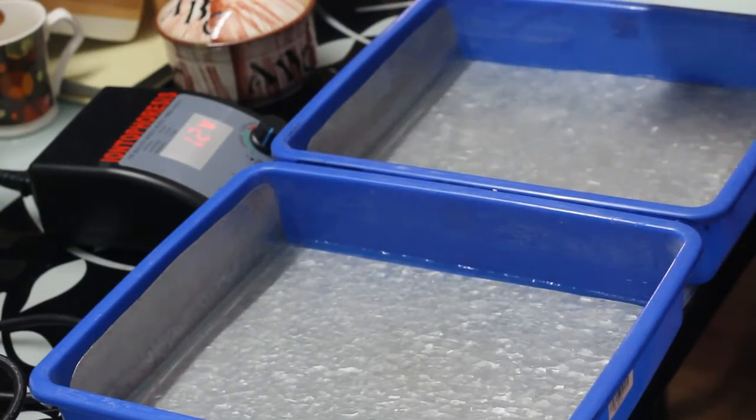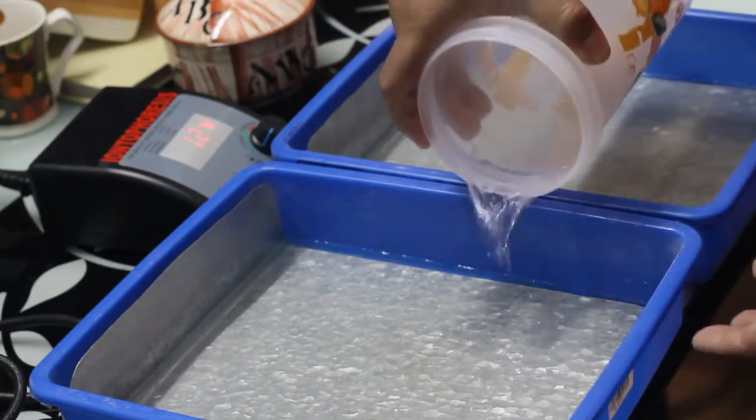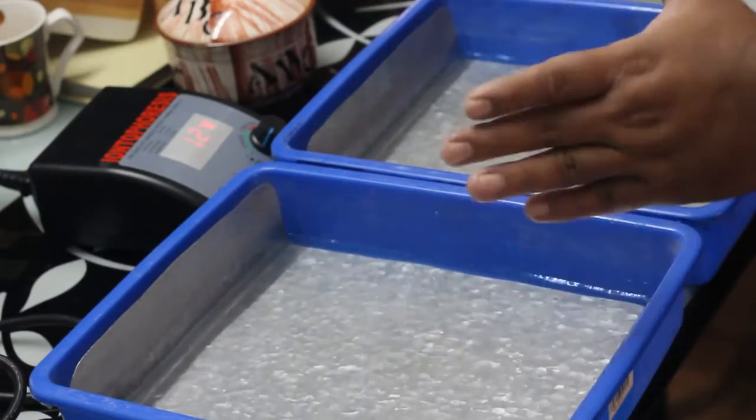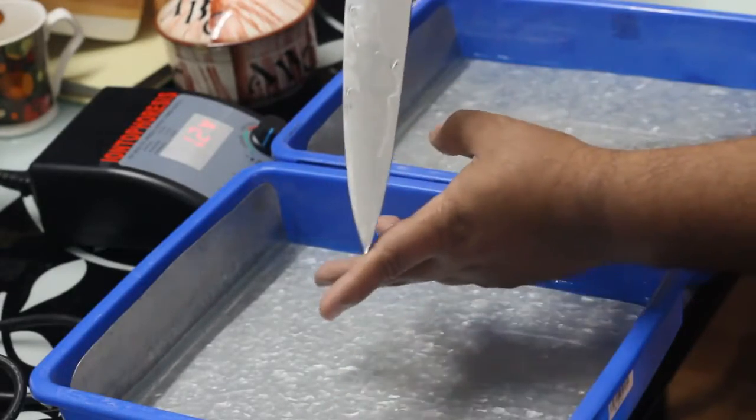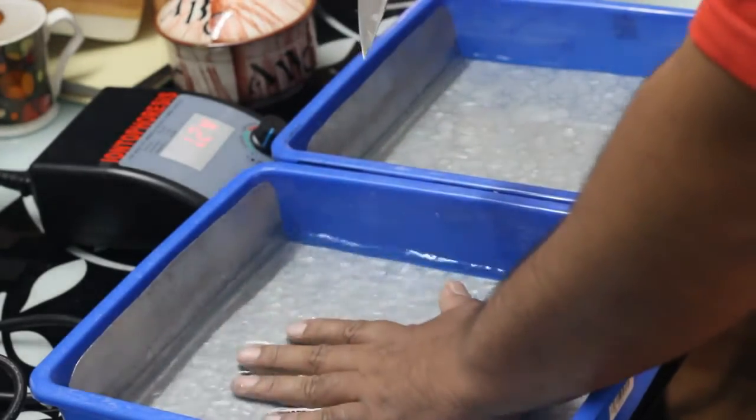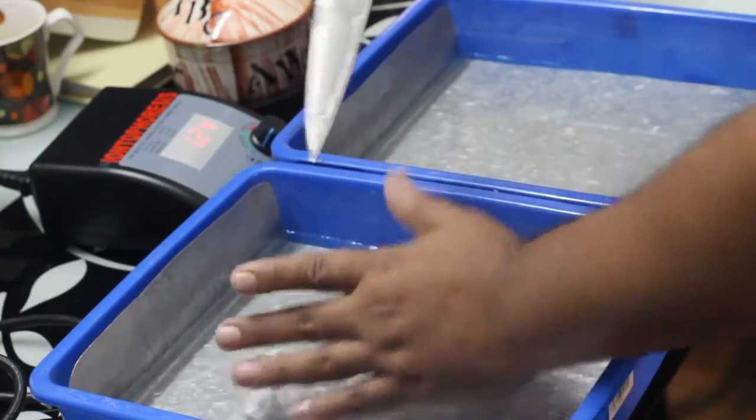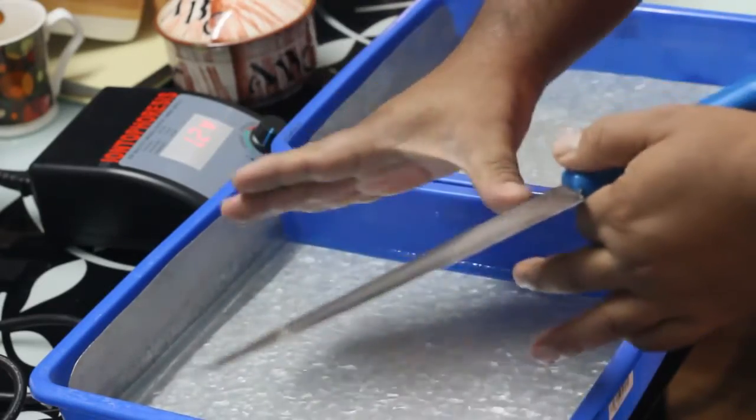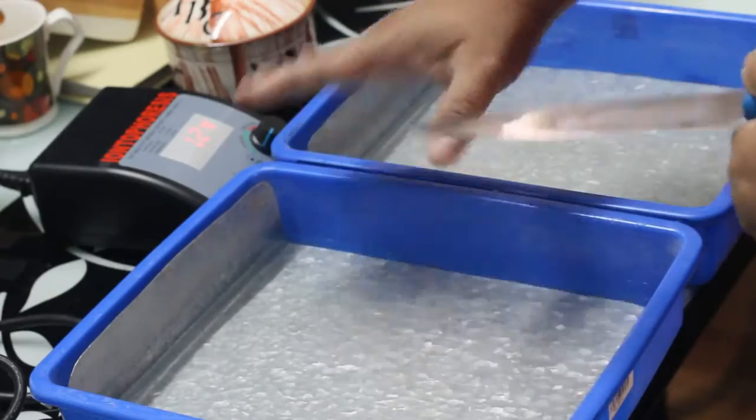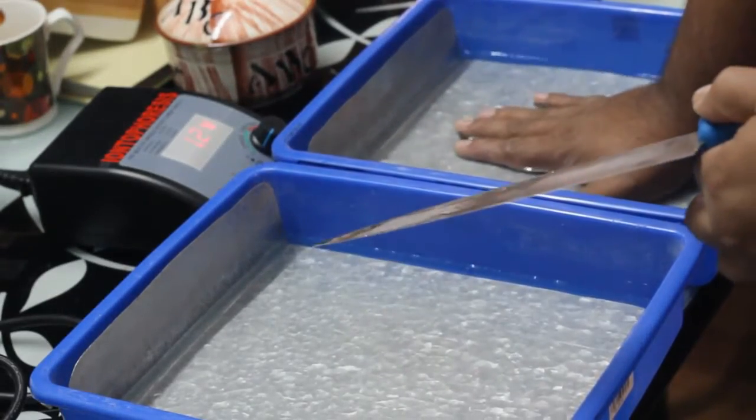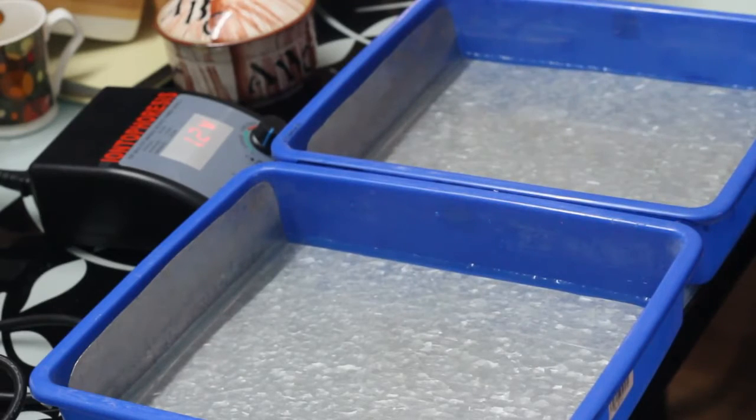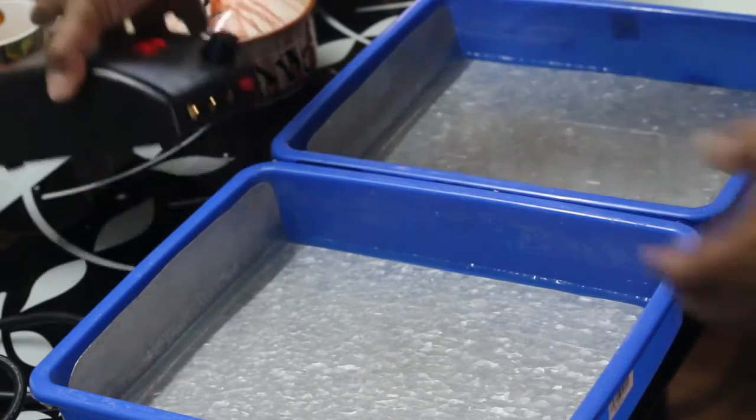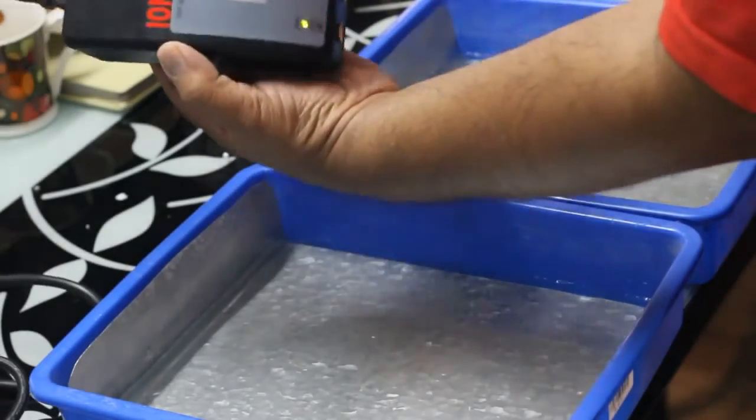Now I'm pouring the water to the proper level. It is understood that you should not cross the water up to the wrist level. There is a white indication on the skin which shows the darker area. You should not extend the darker area of the skin, but the palm area which is white, you can put the water up to that where sweat is coming.